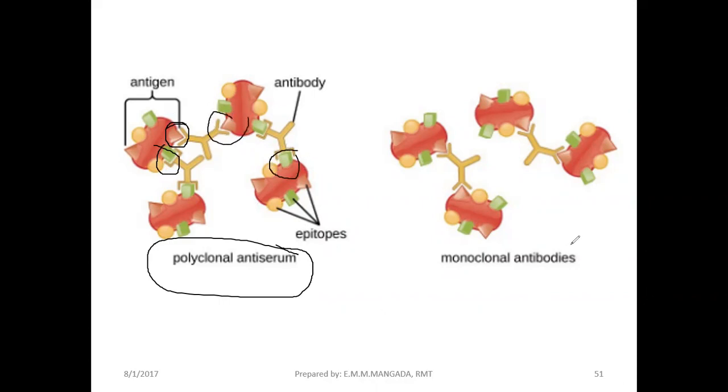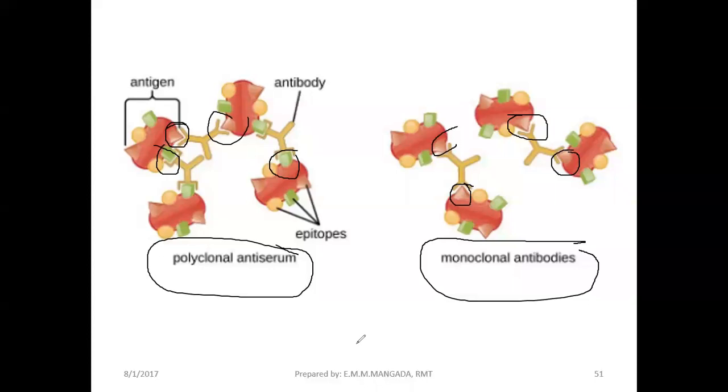Okay? Dito sa monoclonal, pare-pareho sila. Silang lahat ng antibodies natin, nagbabind lang sila dun sa pink antigen. Sorry, pink epitope, I should say. Na portion ng ating antigen. Again, in your polyclonal, the antibodies are binding in the different epitopes in an antigen. Pwedeng si pink epitope or green epitope. Sa monoclonal, single epitope yung kanilang binding. Kung pink silang lahat, pink lahat yan ang binding nila. So that's your monoclonal antibodies versus your polyclonal antibodies.